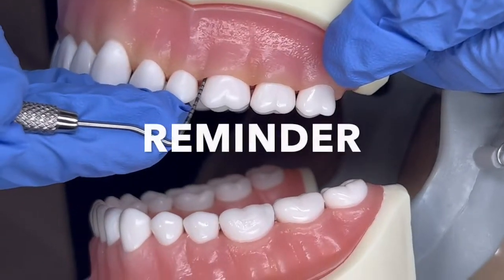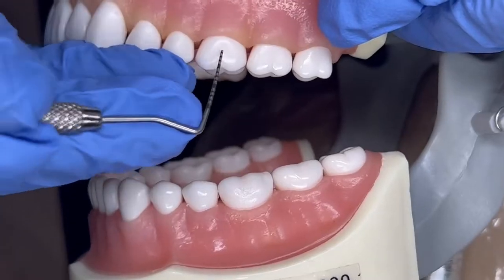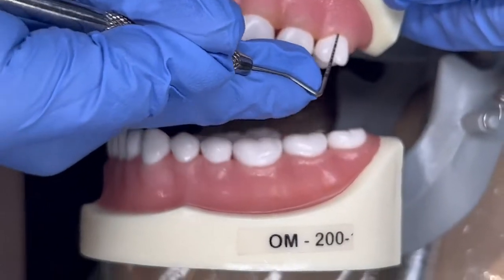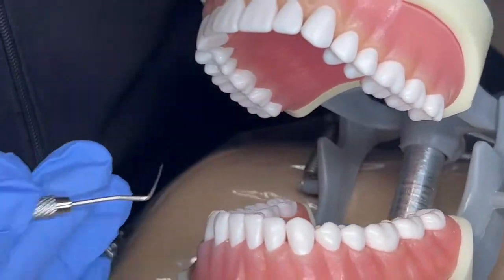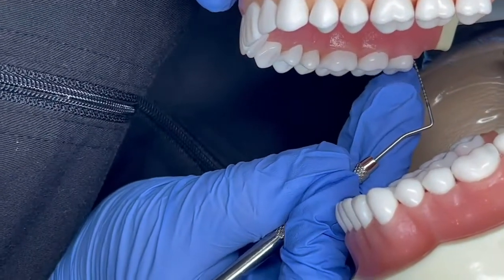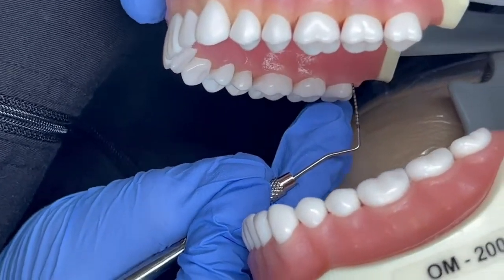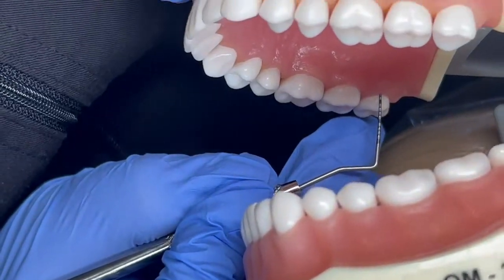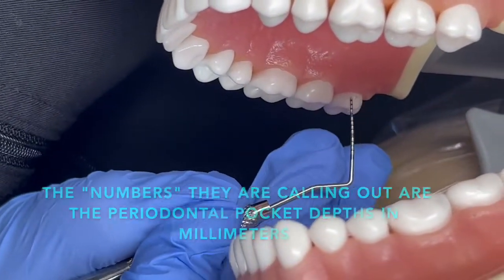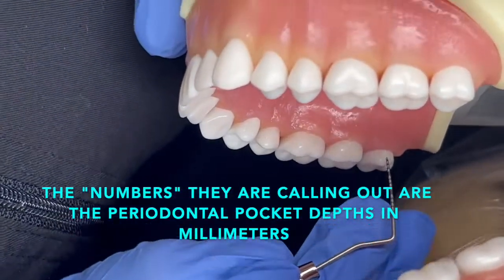Again, hygienists and dentists are the only ones that do the probing — an assistant cannot. You go through and they're going to call off three numbers for every tooth along the facial, then the lingual and do the same thing. I'm going through calling off numbers and the assistant is periodontal charting just the numbers.